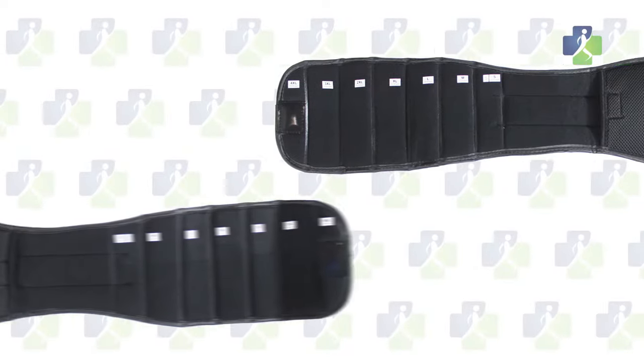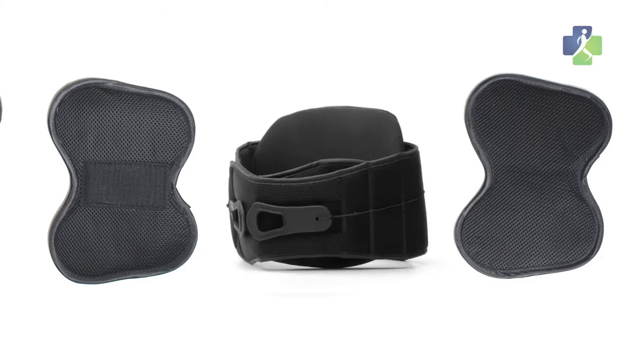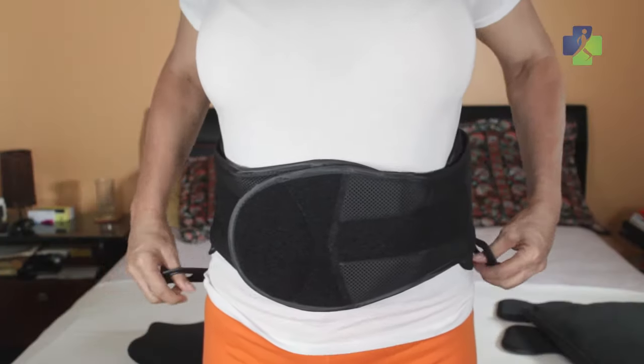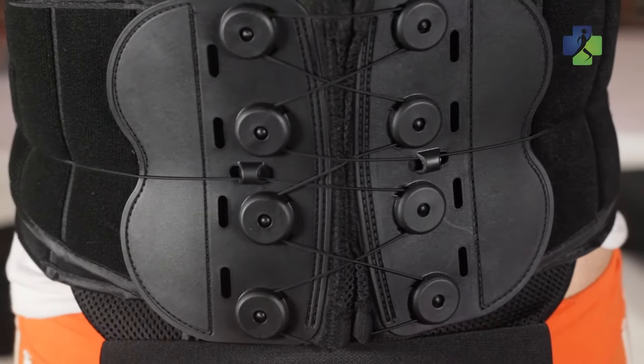The front of the brace includes two anterior front panels for abdominal support. There are also two side panels that can be added for additional side support. The two-handed pulley system offers added intra-abdominal compression, relieving the weight-bearing load on your spine and easing your pain.